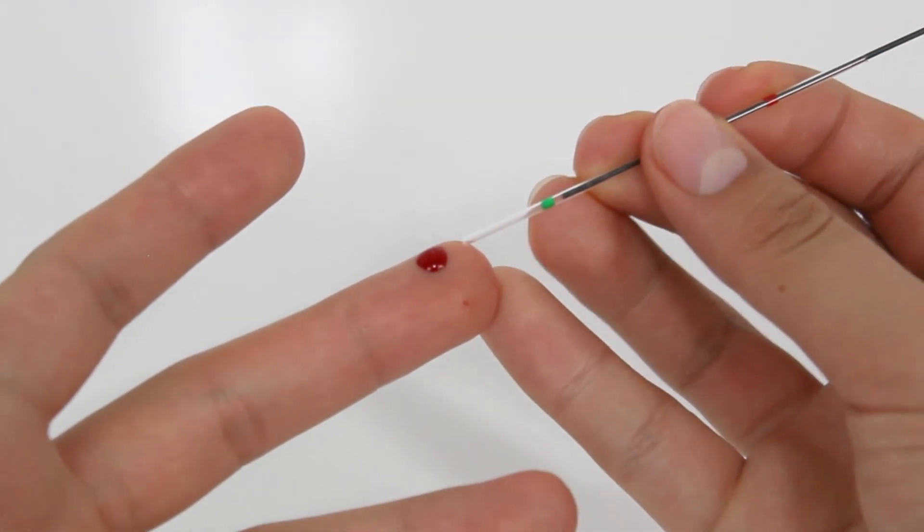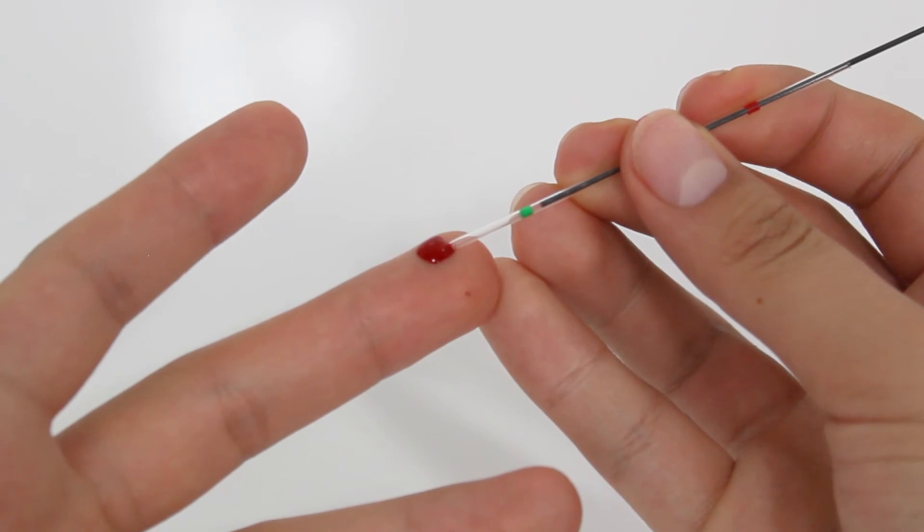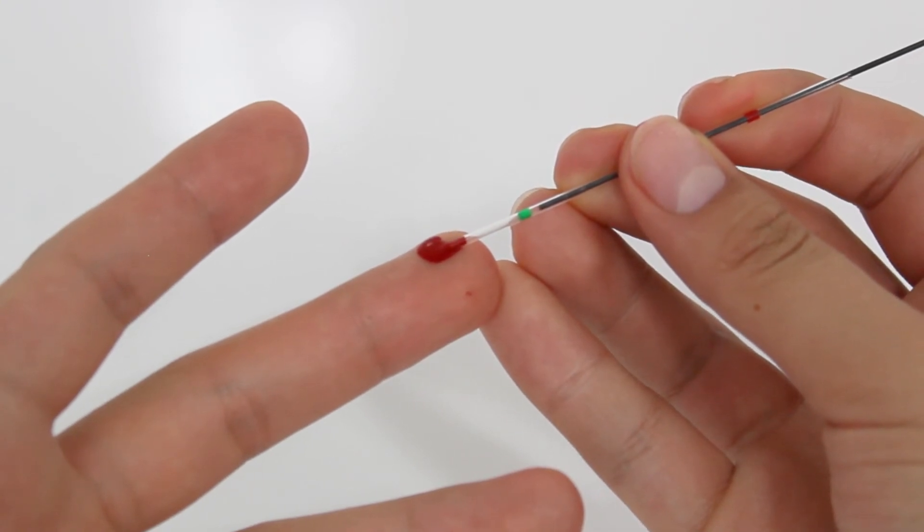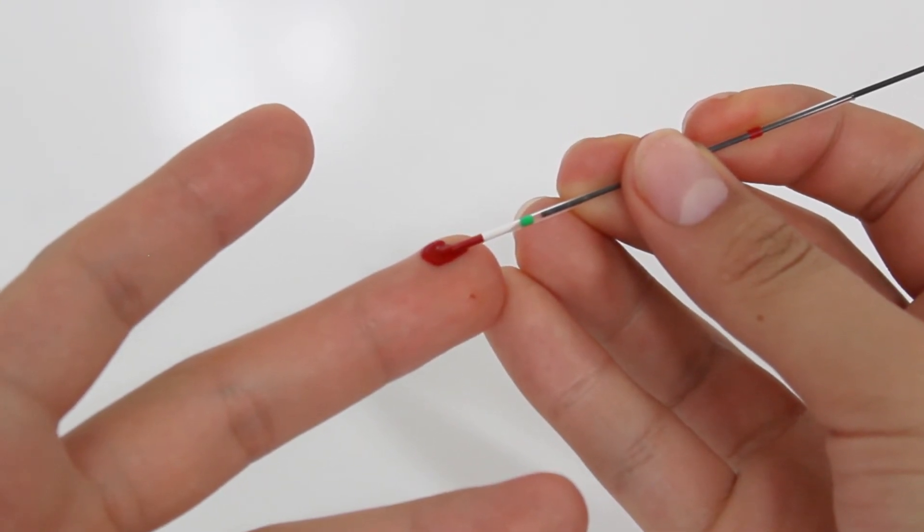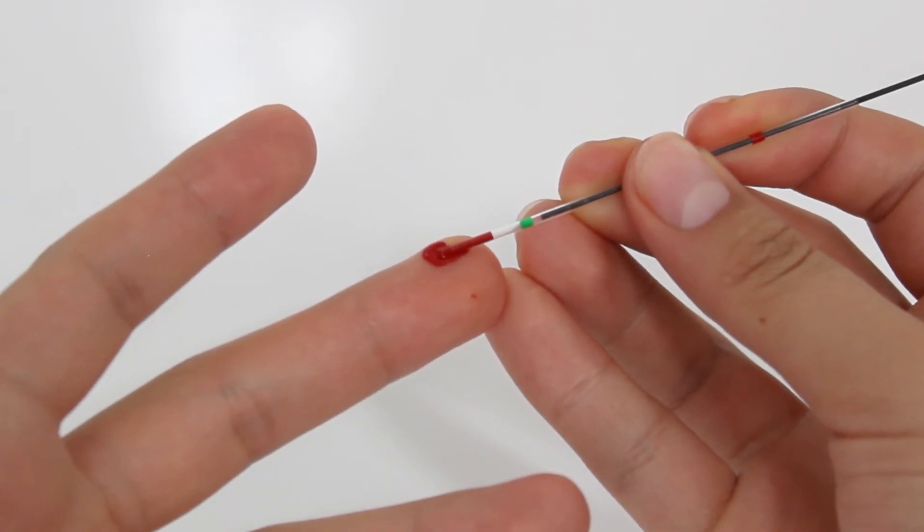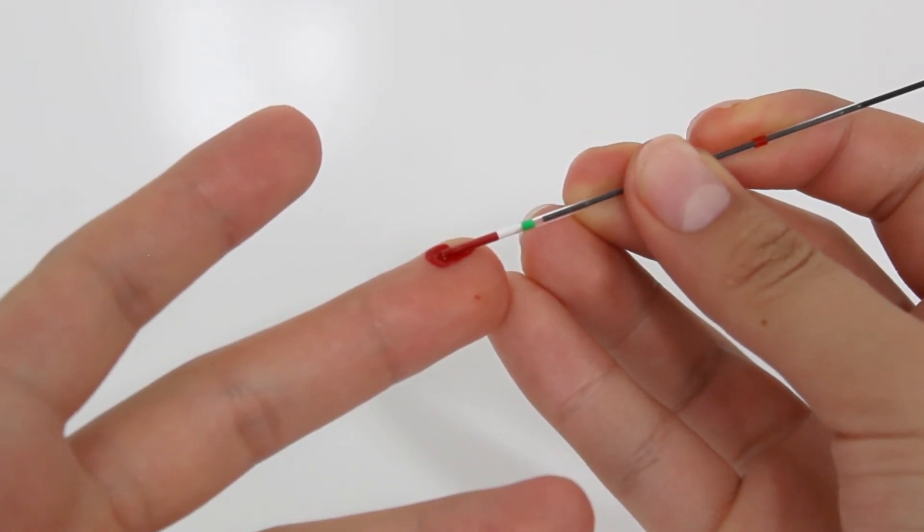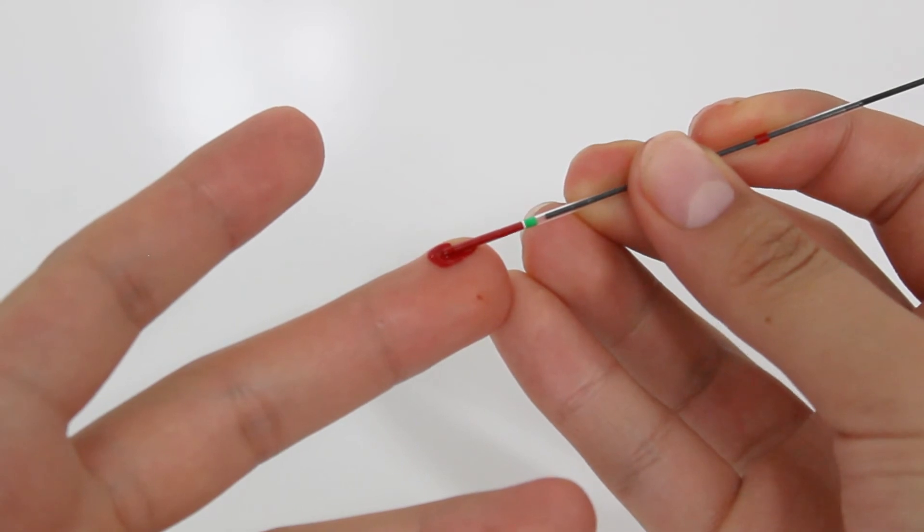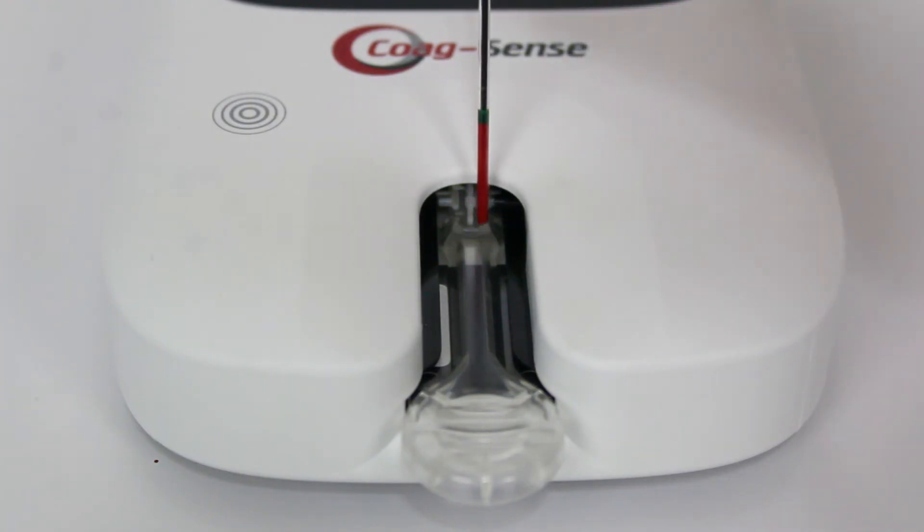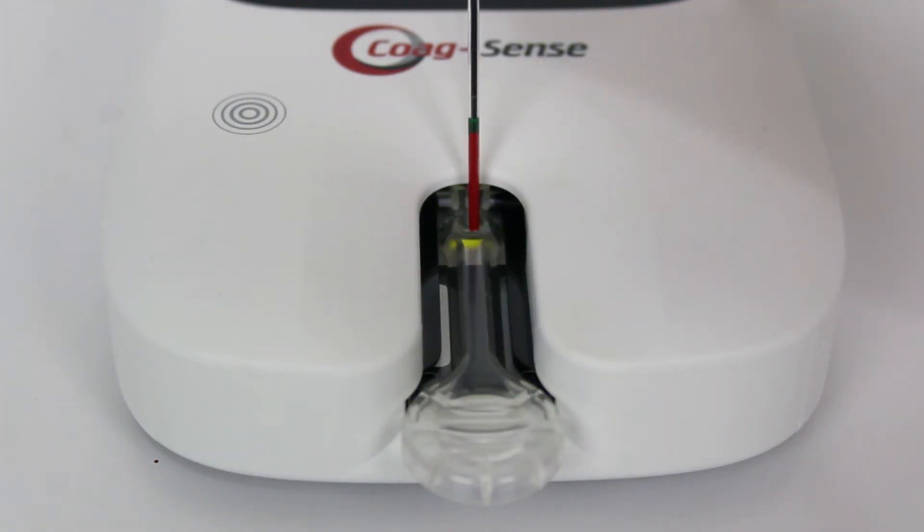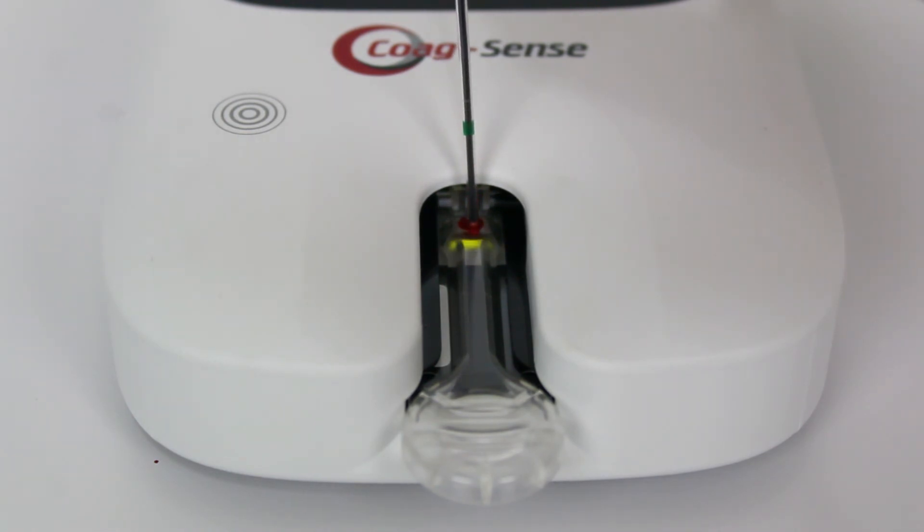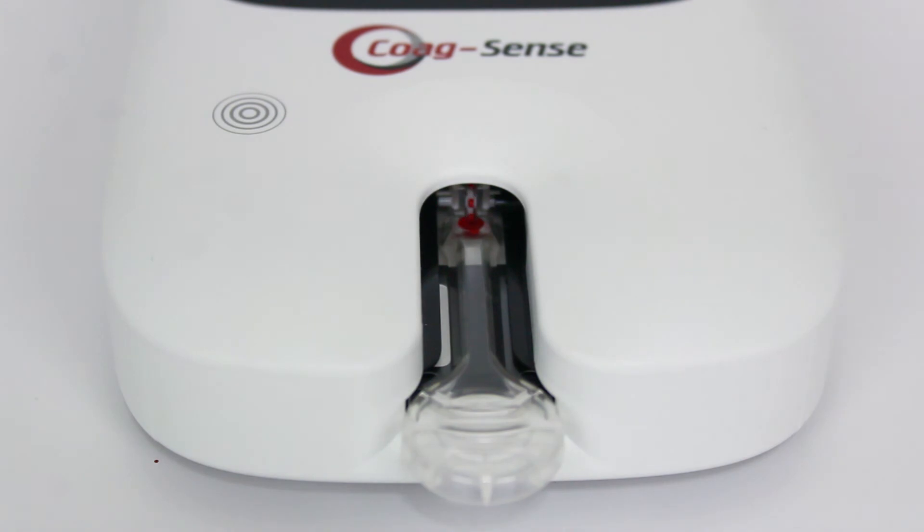Holding the transfer tube horizontal, touch the tip to the bead of blood and let capillary action fill until blood flow stops at the green band. Insert the transfer tube tip into the sample application well of the test strip and touch the tip down at the flashing green light in front of the spinning wheel.